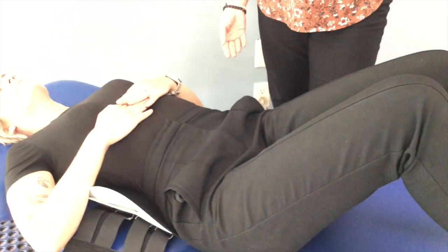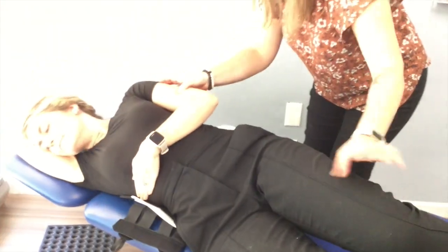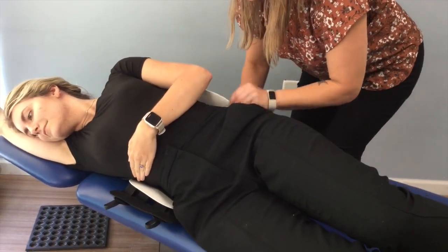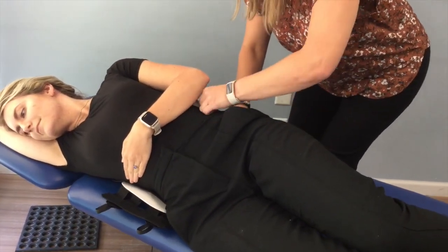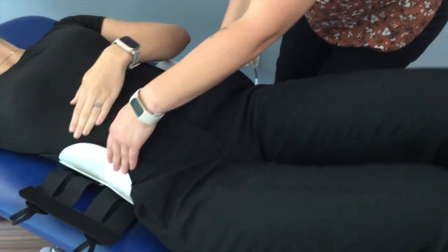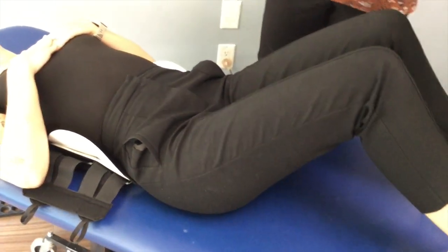Sometimes when we don this brace it can be a bit askew, and what we need to do is just assist the patient in getting it into the correct spot. We're going to ask the patient to do a half log roll towards the camera, and I'm going to assist by lining this up, again looking for anatomical landmarks — the waist — and then having her log roll back towards me. She's now centered on the posterior shell.